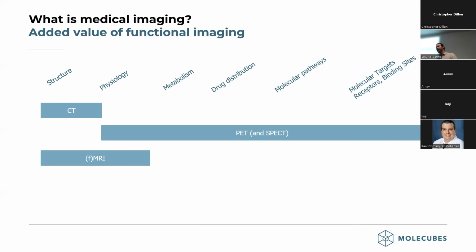One comparison, there's a slight comparison that can be made between the optical and the PET and SPECT imaging, but where PET and SPECT truly go further is in the sense of having a much better quantification potential at any depth in your animal. Optical, there's only so much depth penetration inside, and also at a much higher resolution.